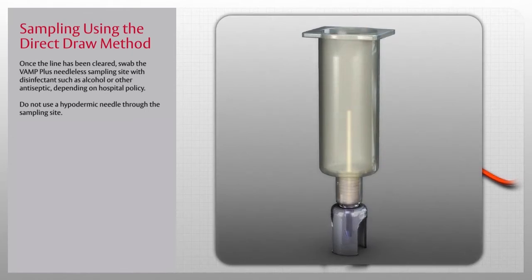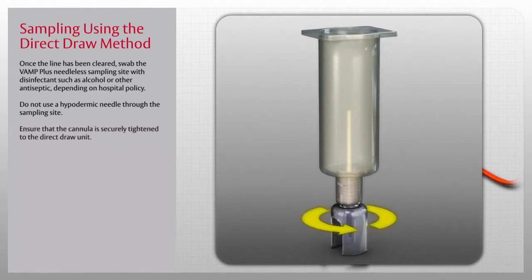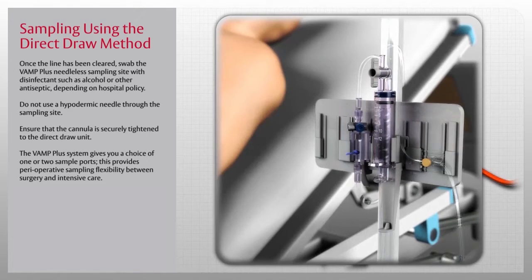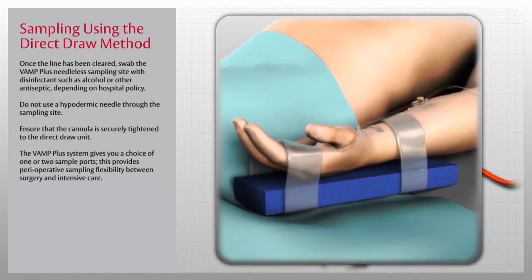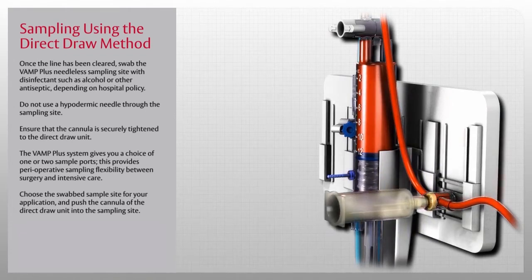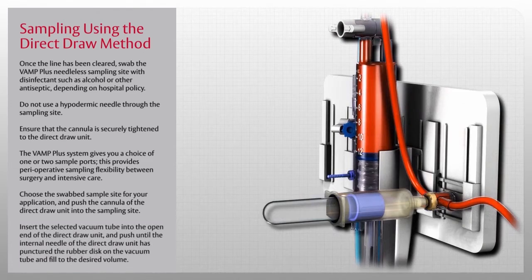To draw a blood sample, use the VAMP direct draw unit. Do not use a hypodermic needle through the sampling site. Using aseptic technique, peel open the pouch of the direct draw unit and ensure the cannula is securely tightened. The VAMP Plus system gives you a choice of one or two sample ports, providing perioperative sampling flexibility between surgery and intensive care. For example, an anesthesiologist may choose the sample site nearer to the disposable pressure transducer and reservoir, whereas an ICU nurse may choose the site nearer to the patient. Push the cannula of the direct draw unit into the swabbed sampling site, insert the selected vacuum tube into the open end, and push until the internal needle has punctured the rubber disc on the vacuum tube. Fill to the desired volume and repeat as required for additional tubes.